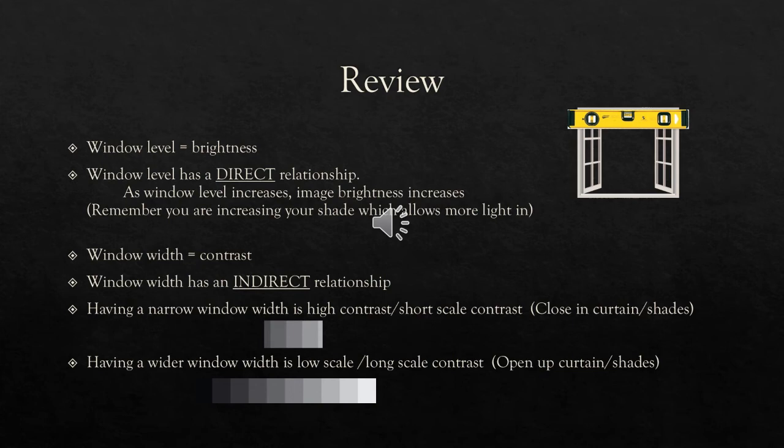Remember, having a narrow window width is high contrast, short scale. This is closing in the curtains into the middle. Having a wider window width is low contrast, long scale. Open up the curtains to allow more shades of gray.